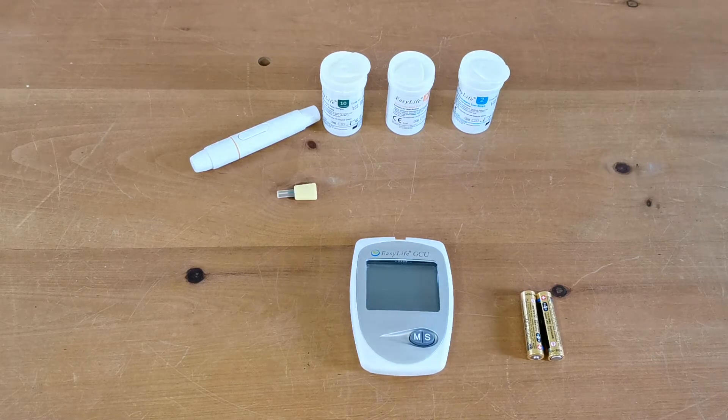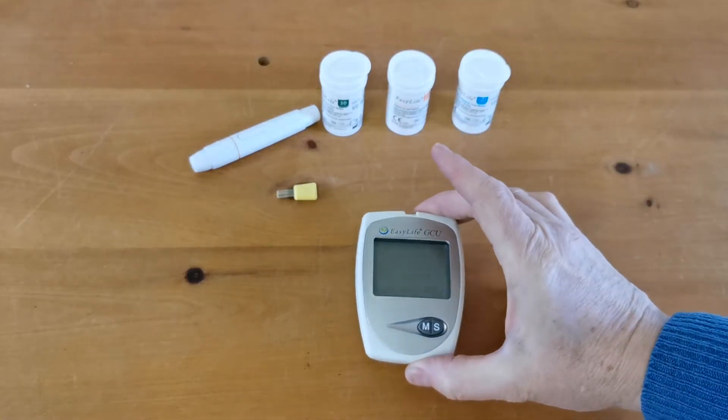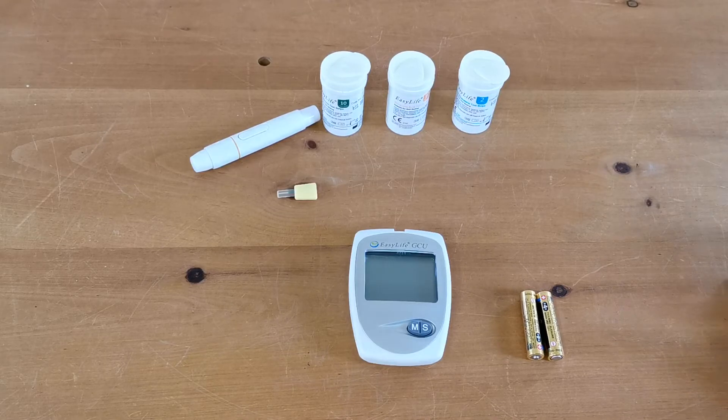Welcome back to this second video in the setup demonstration for the EasyLife GCU triple function meter. In this video we're going to show you how to insert the batteries when you first get the meter, set the time and date so you're ready to run your first tests, and how to use the test meter to confirm that the setup has been correct.